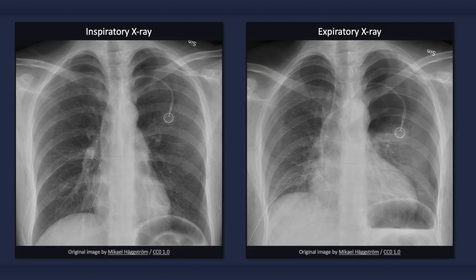Normally the chest X-ray is performed with the patient on inspiration. Can you detect the pneumothorax on the inspiratory X-ray? Now how about on the expiratory X-ray? Occasionally the air between the lung and the pleural space is easier to detect with an expiratory image.